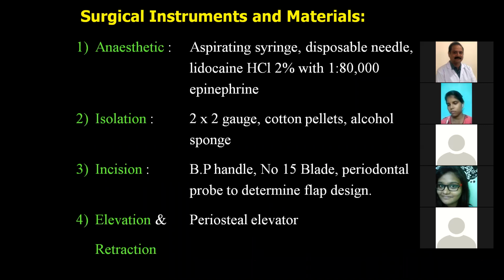So going to surgical instruments, I think we are familiar with all these things. For elevation and retraction, the most simple periosteal elevator which you use in oral surgery is enough.